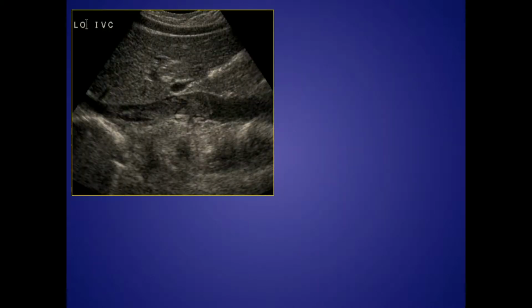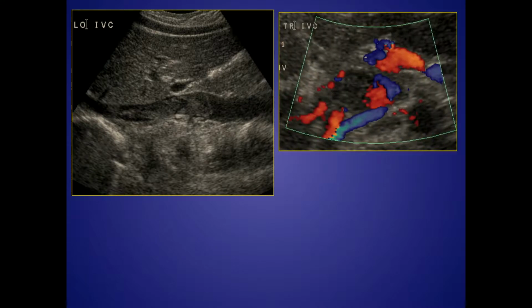Here's an example of a patient that has this partially occlusive thrombus just sitting in the IVC. And this is the kind of patient I very gingerly walked away from because I didn't want to dislodge it and necessarily cause a pulmonary embolism. And of course, I'm sure the patient was having some PEs occurring, but this looked like a relatively larger clot. And we could see that it wasn't completely occlusive as we can see flow that's around it. So it was just sort of sitting there.